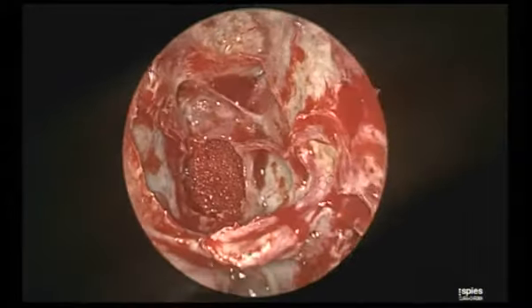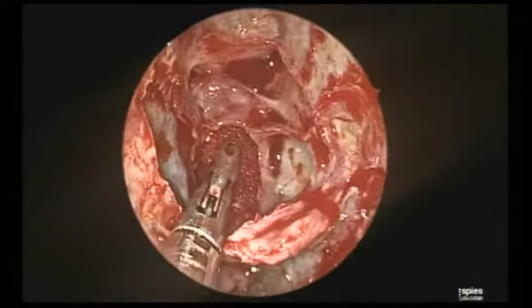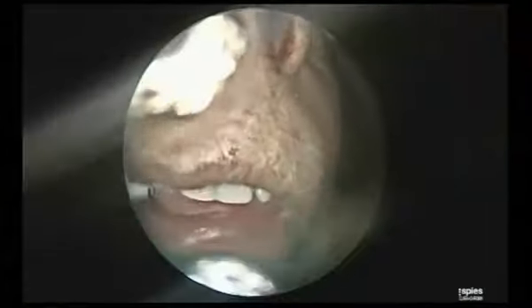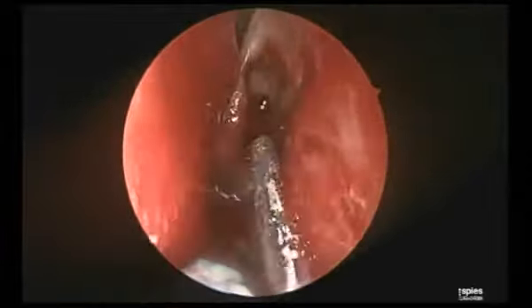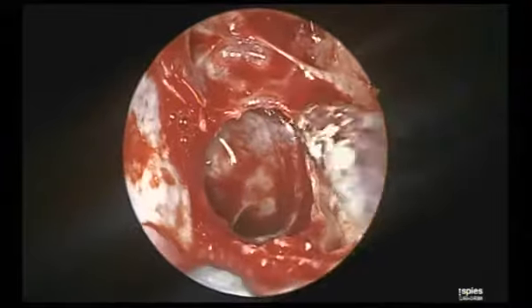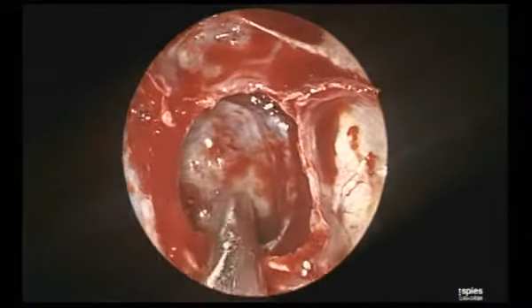The best way: if you identify the optic nerve, the post-ethmoidal artery is 5 to 6 millimeters anterior to the optic nerve. That is the most reliable landmark, and the optic nerve is more easily identifiable.